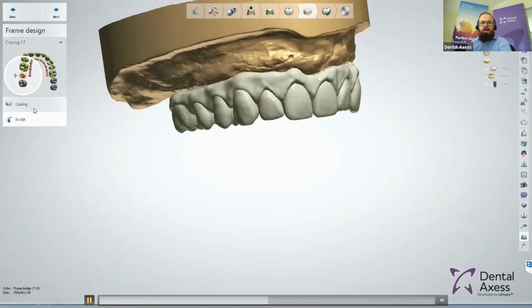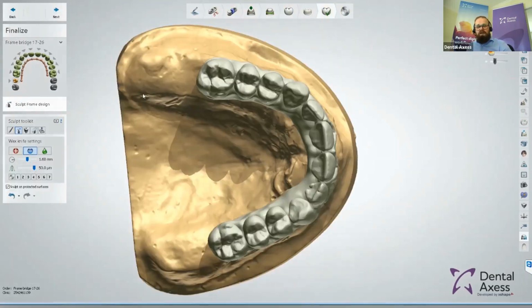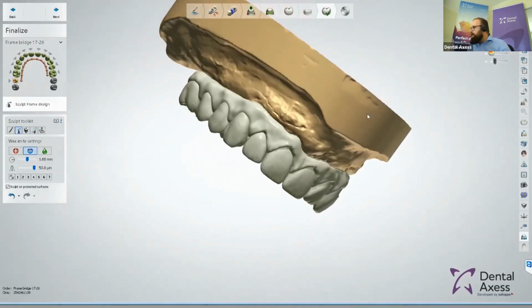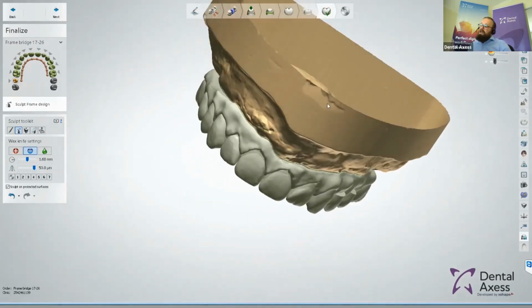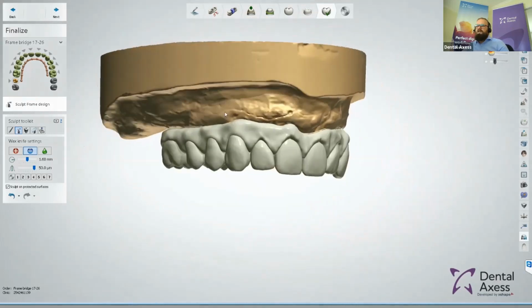And here we got our design already. Don't get me wrong, now you directly see the gingiva, that takes some designing. So it makes just a flat coping, basically a flat layer on top of it, and you have to design on top of it. So yes, it is some extra design work, but you are still able to design something in just the crown and bridge work module. You don't need that advanced thing. It is some more work, so yes. You have to realize that one.